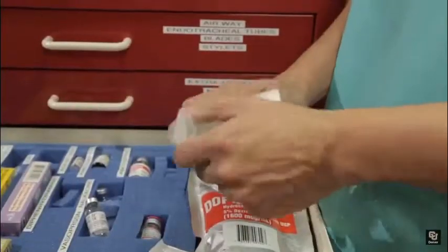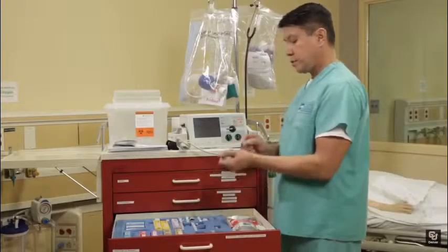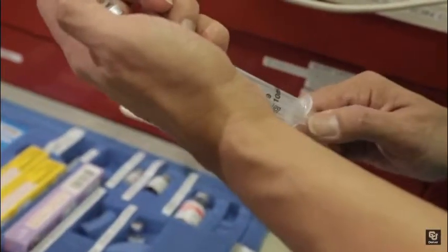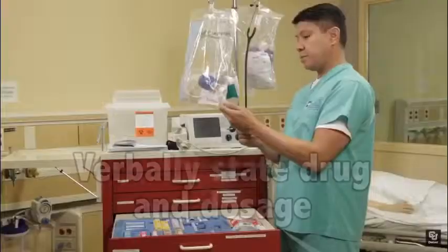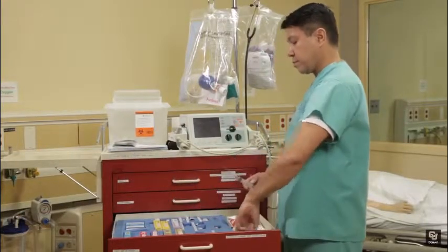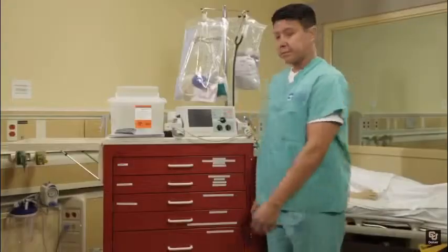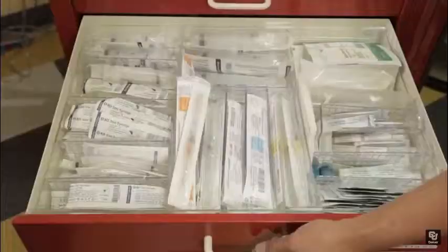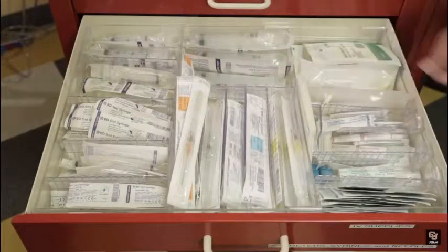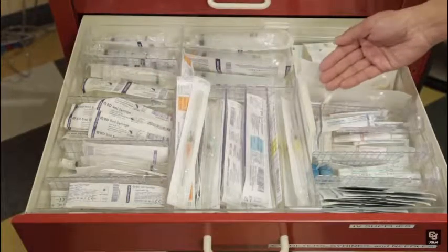To administer one of the drugs, take a needle and syringe, draw up the proper dosage for your simulated patient, and give the medication via the IV tubing. Please verbally state the drug and dosage. Place any used needles and syringes in the sharps container. The fourth drawer is the IV supply drawer and contains catheters, needles, syringes, and adhesive tapes.